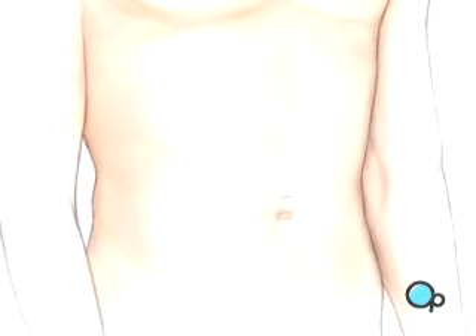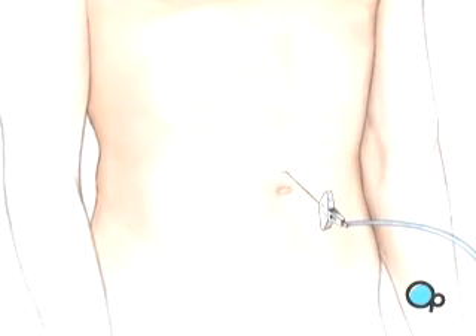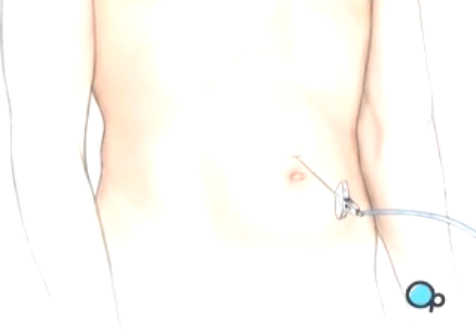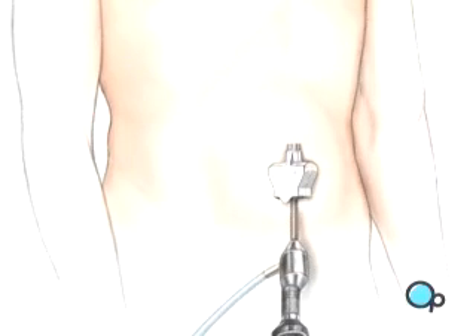After allowing a few minutes for the anesthetic to take effect, a small incision is made above the umbilicus. Then a hollow needle will be inserted through the abdominal wall, and the abdomen will be inflated with carbon dioxide. An umbilical port is created for the laparoscope.